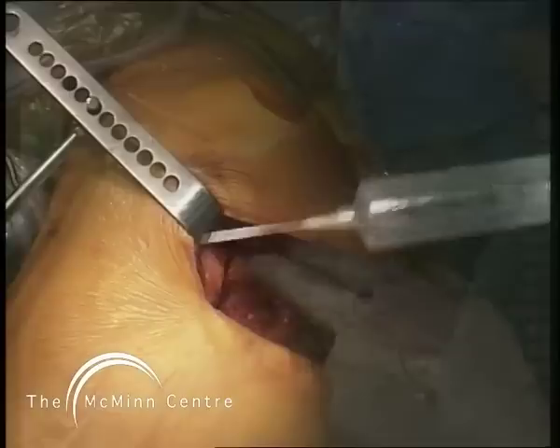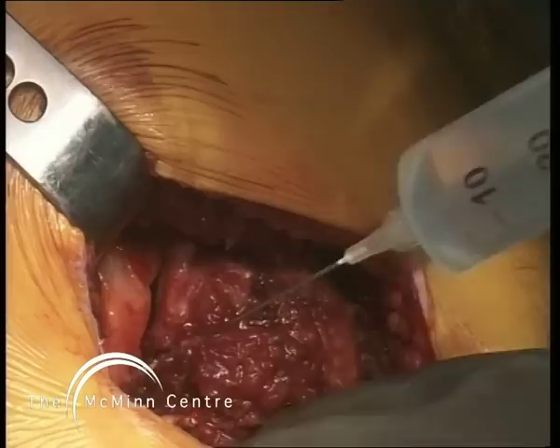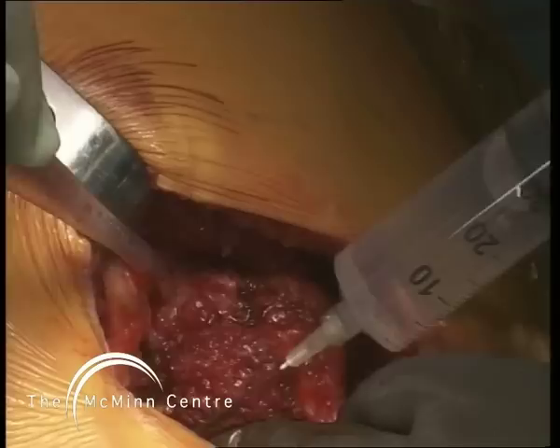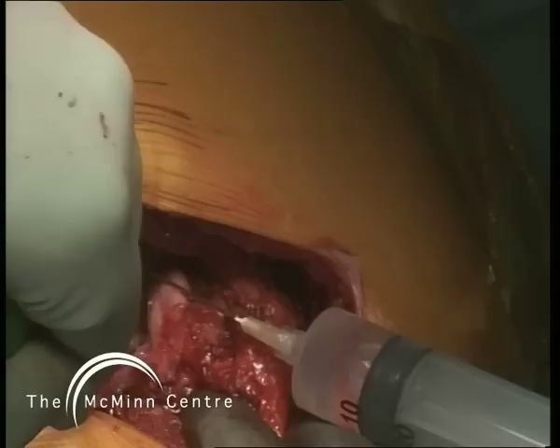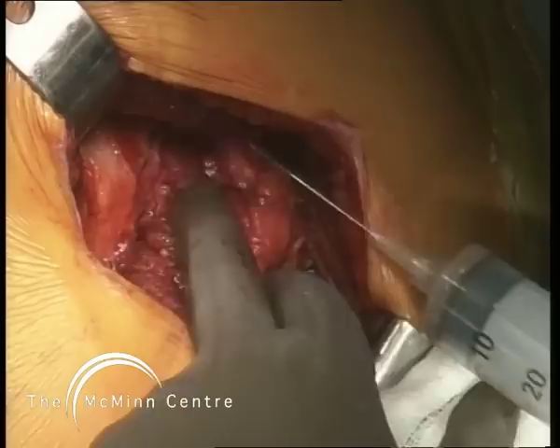Our second dose of ropivacaine and adrenaline is now put into the external rotators, capsule, and all other exposed and cut soft tissue. This is a wonderful addition in my practice because it gives the patients at least 12 hours of totally pain-free recovery following surgery, without the disadvantage of sleepiness or sickness from opiate-type drugs, and without the disadvantage of urinary retention from spinal or epidural anesthesia.